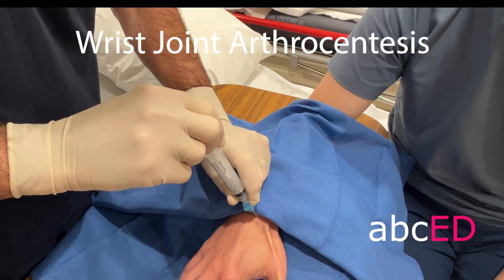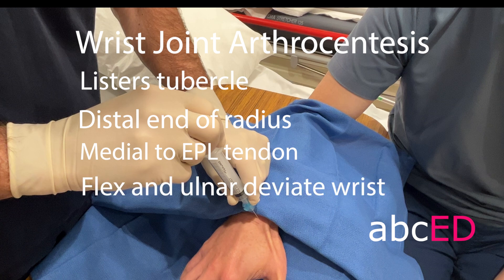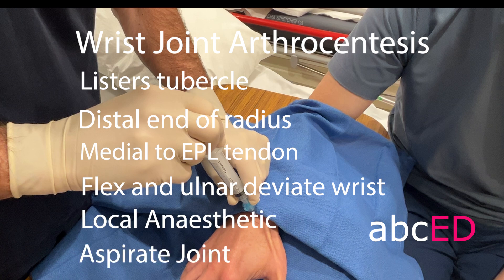Wrist joint arthrocentesis: the landmark is Lister's tubercle, which is at the distal end of the radius, and medial to the extensor pollicis longus tendon. Clean and drape as you would for any sterile procedure. Then flex and ulnar deviate the wrist, infiltrate local anesthetic, and then aspirate the joint. And that's how you aspirate a wrist.